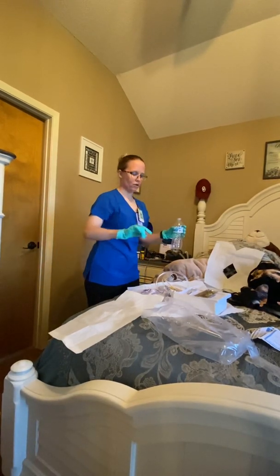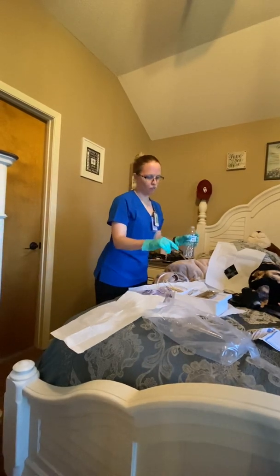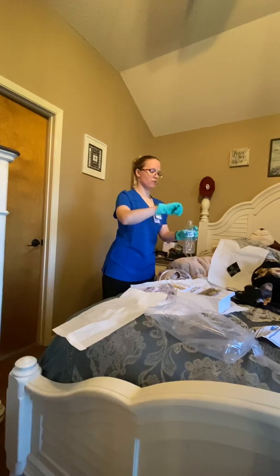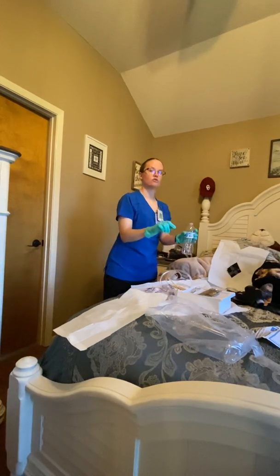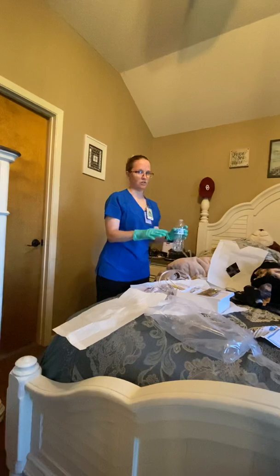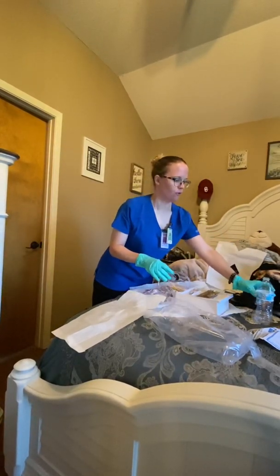So how we're going to cleanse the penis is we're going to use our swab sticks. Grab the first swab stick, and we're going to clean from the inside to the outer in a circular motion, then discard it. We're going to do this 2 more times, so a total of 3 times. That's for cleansing the penis. Now I'm going to show you with the female.